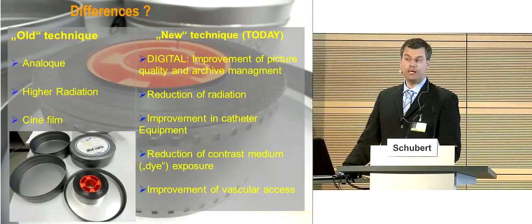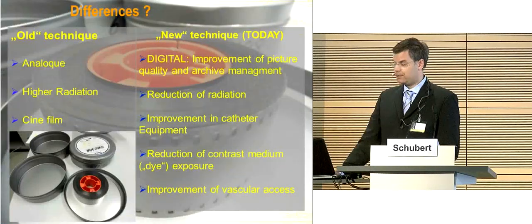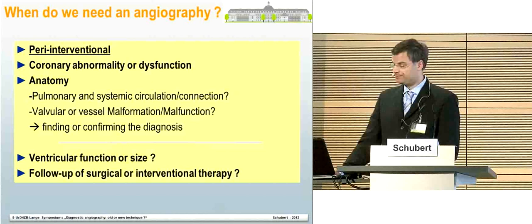Another advantage is that today I think we have a reduction of radiation. We have an improvement of catheter material. We can use it and we can make the angio. And we also have improvement in the vascular access. So we have some new techniques available.